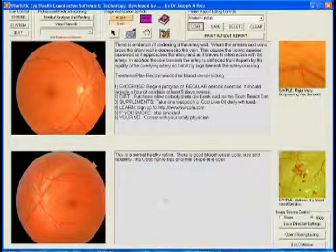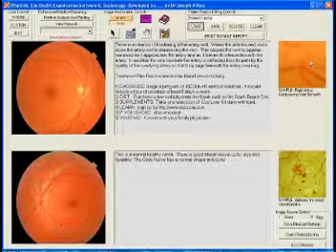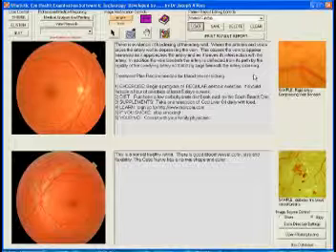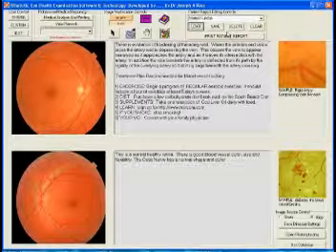This is a sample of hardening the arteries. This is a sample of diabetes, because people frequently ask us about that, and we frequently find these things. So we give them a reference point. Now, at that point, we're done. In my office, this will take about 1.5 minutes.